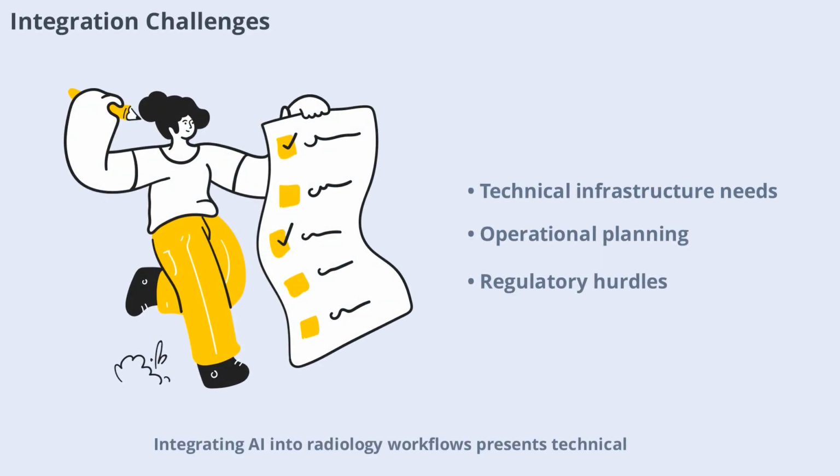Integrating AI into radiology workflows presents technical, operational, and regulatory challenges. Robust computational infrastructure, development environments, and clinical system integration are essential. Operational hurdles include strategic planning, staff education, and managing multiple AI tools. Regulatory challenges involve obtaining FDA clearance and ensuring ethical, clinically valid AI solutions. Continuous monitoring and post-production evaluation are necessary for safe and effective AI deployment.